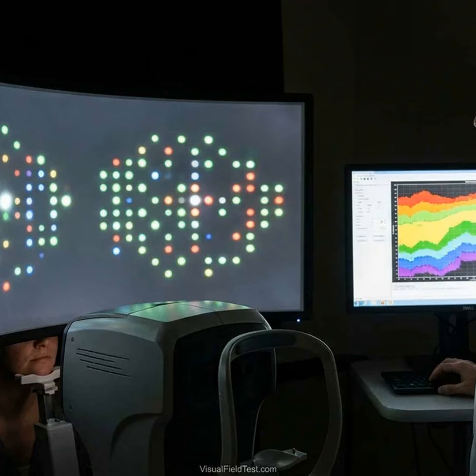Color and contrast-specific perimetry, blue-yellow, SWAP. Blue-yellow perimetry, SWAP, is a well-known color test. It uses a large, narrow-band blue stimulus, around 440 nanometers, presented on a bright yellow background. The high-luminance yellow field adapts the red and green cones so that the remaining pathway, the short-wavelength, blue cones and their small bistratified RGCs, respond mainly. In effect, SWAP isolates the blue cone channel.